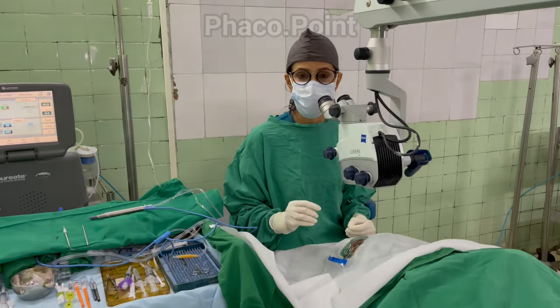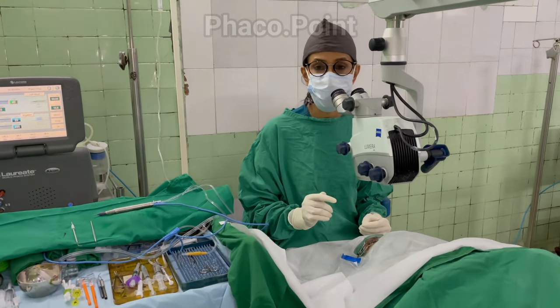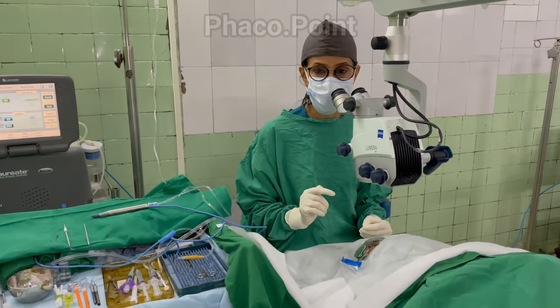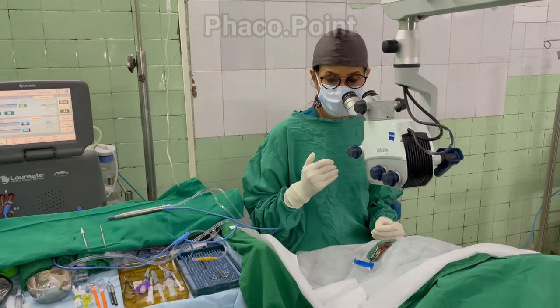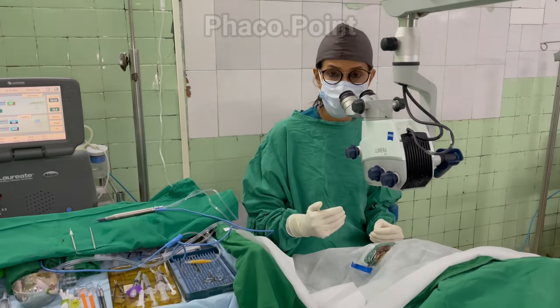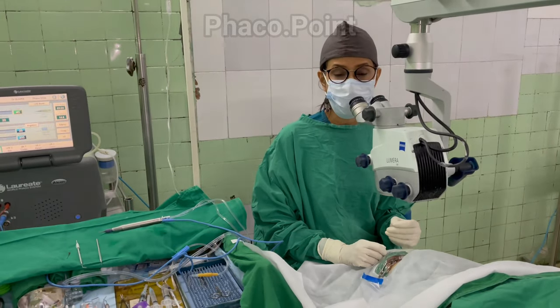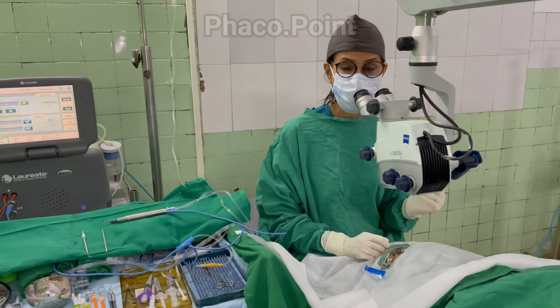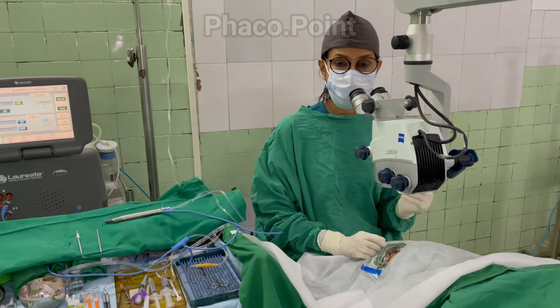Let's go through the checklist every surgeon should ideally complete before starting phacoemulsification. Step one: know the patient's name — especially in a busy list — so you can address the patient during surgery and establish a connection. Step two: having already examined the patient on the slit lamp, you should know the grade of the cataract and have decided on the nucleus disassembly technique you are going to use.